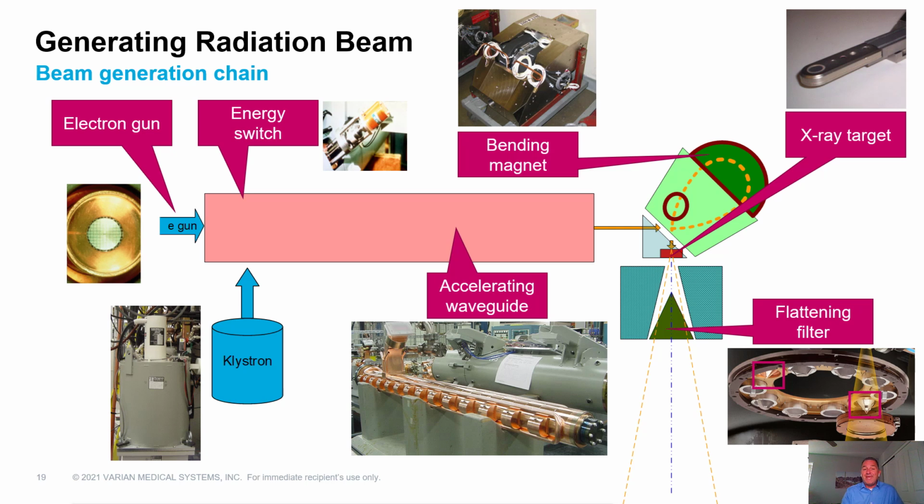When we near the end of the beam transport system into the LINAC treatment head, where the clinical X-ray beams are being produced upon hitting our tungsten target, afterward, the new X-ray photon beam goes through that primary collimator. The clinical electron beams bypass that target because it's going to remain pure electrons. And they go to their primary collimator, they go through it, and they hit the scattering foil.